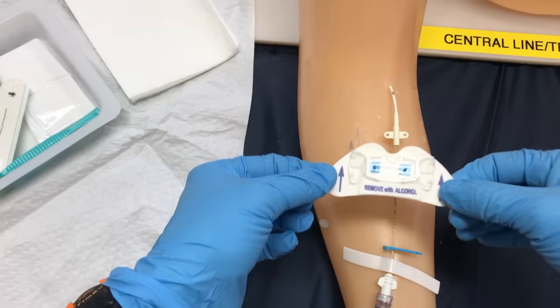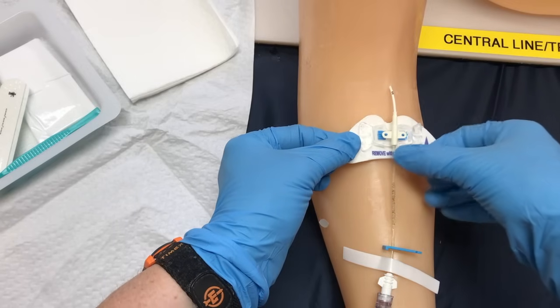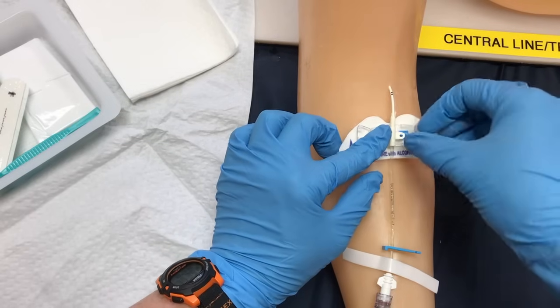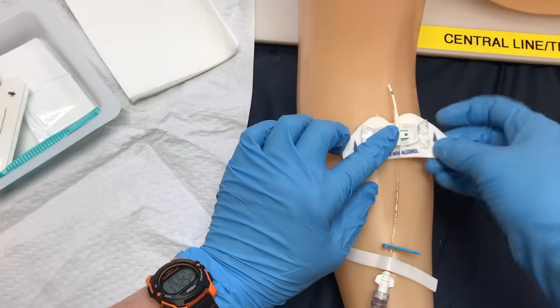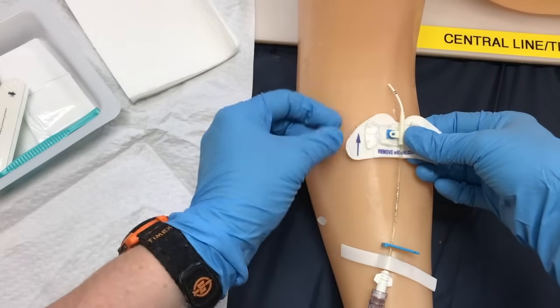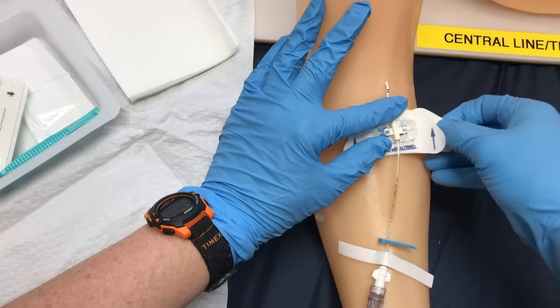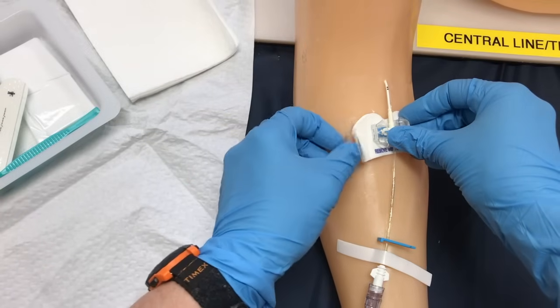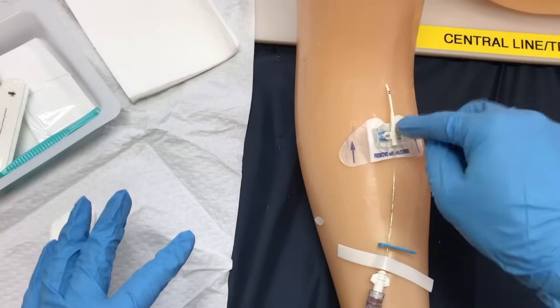We're going to take our STAT lock first — arrows pointed towards the insertion site — and we're going to slip this in and secure it. Just to remind you, these are sterile gloves so I can touch the sterile fields I've cleaned and am working in. Close off these clamps and secure. Now my PICC line is secure.